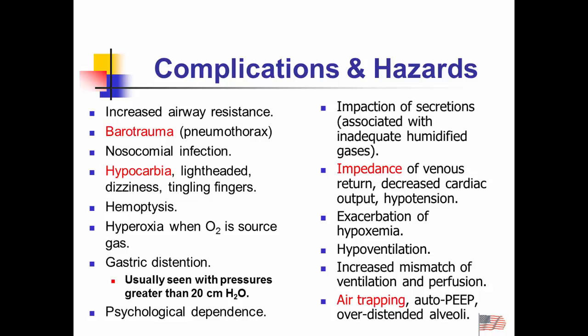We can have the patient develop tingling in their fingers, lightheadedness, dizziness, simply because we're blowing off too much CO2. Okay? It's not the medication that's causing it, it's just the technique. You can see the same thing with incentive spirometry. You can see the same thing with a small volume nebulizer. If the patient's breathing too fast, they're going to blow off CO2, and you'll get that tingling in the fingers and lightheadedness, etc.